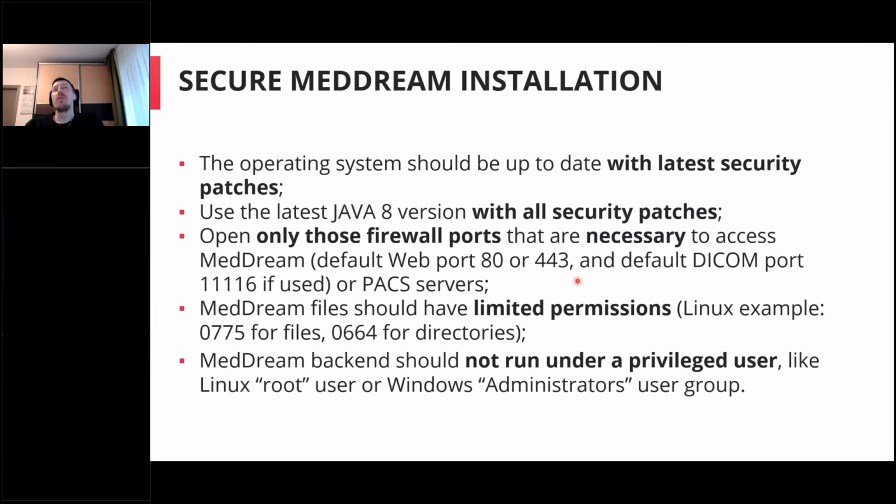Of course, if we talk about the MedDream installation and the server environment, the operating system where you are installing MedDream should also be up to date with the latest security patches and updates. It needs to have the latest Java 8 version with all the security patches, of course.